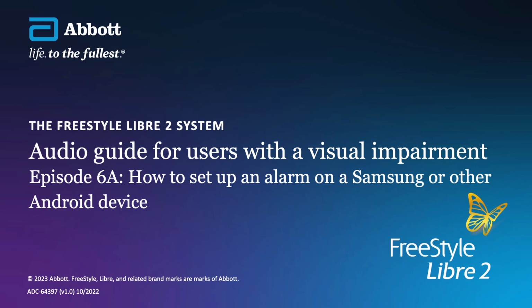Access the alarm screen through the main menu. This is the third option down. On the alarm screen, you will find 3 alarm options. From the top left down, these are low glucose alarm, high glucose alarm, and signal loss alarm. All alarms are switched off by default.